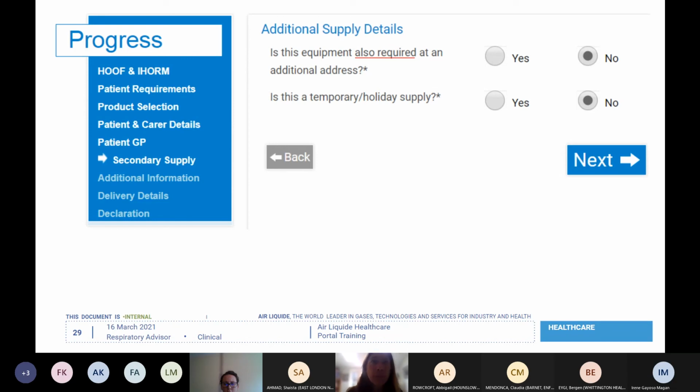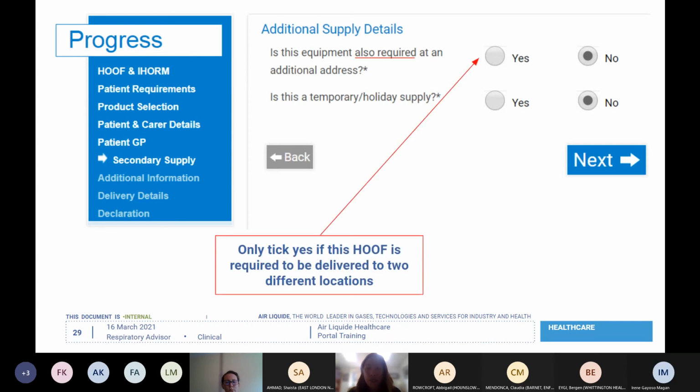As a third-party supplier, contractually, we provide what we call P numbers. So for each account, even if the child has 2 or 3 accounts, they will have a different P number because it will be a different address, which is allotted to them. Okay. So if you don't need this additional supply, you just tick no.